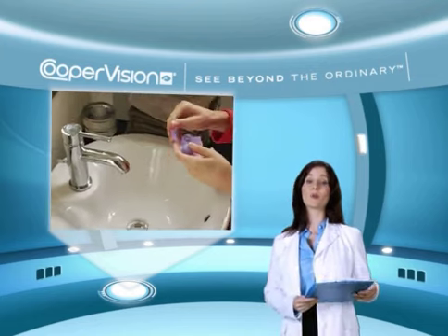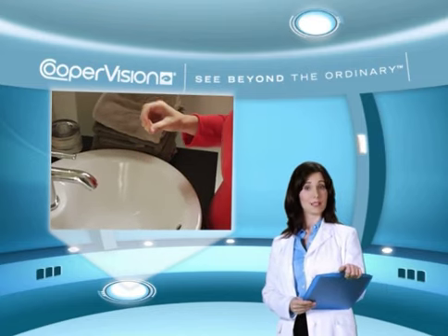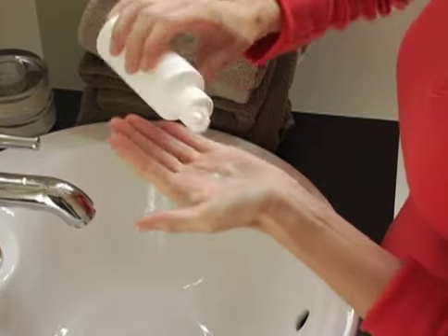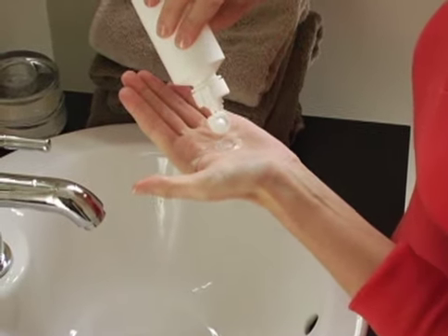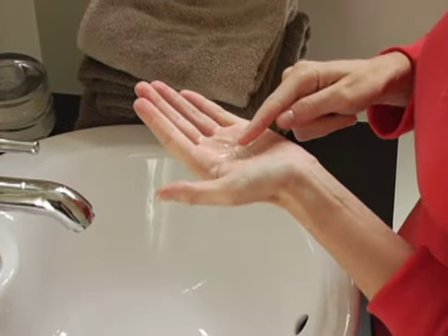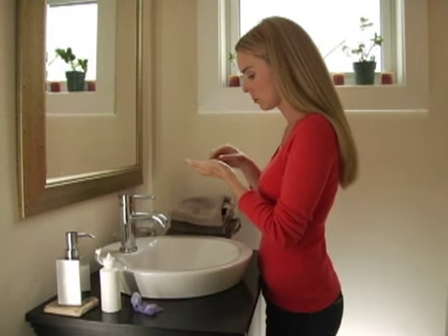Always start with your right eye when inserting your lenses. Remove the contact lens from your case and place the lens in your left palm. Gently rinse your right contact lens with the solution recommended by your eye care practitioner to remove all traces of debris. Once you've finished rinsing, examine your lens for any particles, deposits or tears.